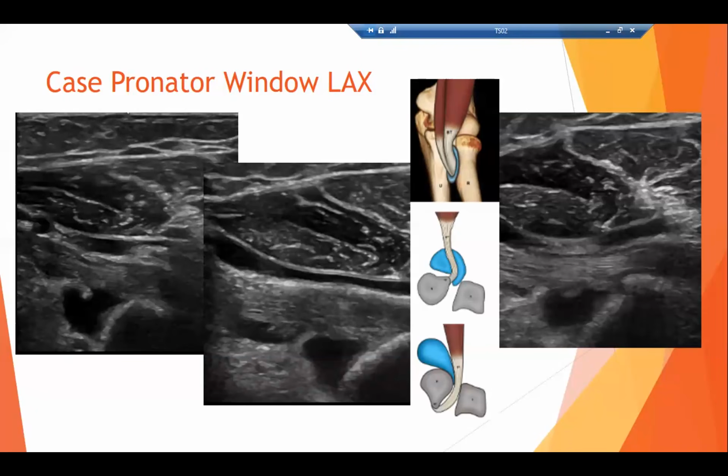Just a couple quick other comments. Sheila, nice job. I don't really have anything new that you didn't say. I do want to highlight a couple points though, because I think they're important. You mentioned home base, and I love that term because with so many exams, I think we need a foundation of where to start. That is my home base. That is my first image in the anterior elbow protocol. In fact, it's my first image in any elbow protocol that I have.